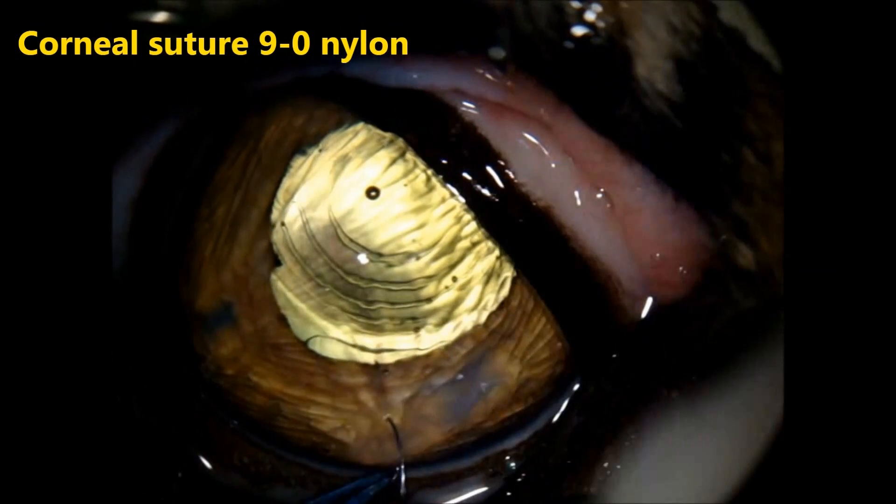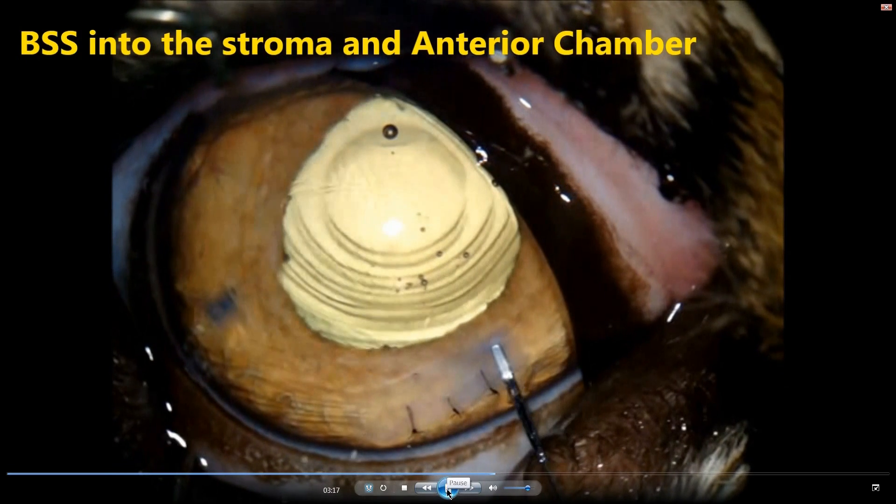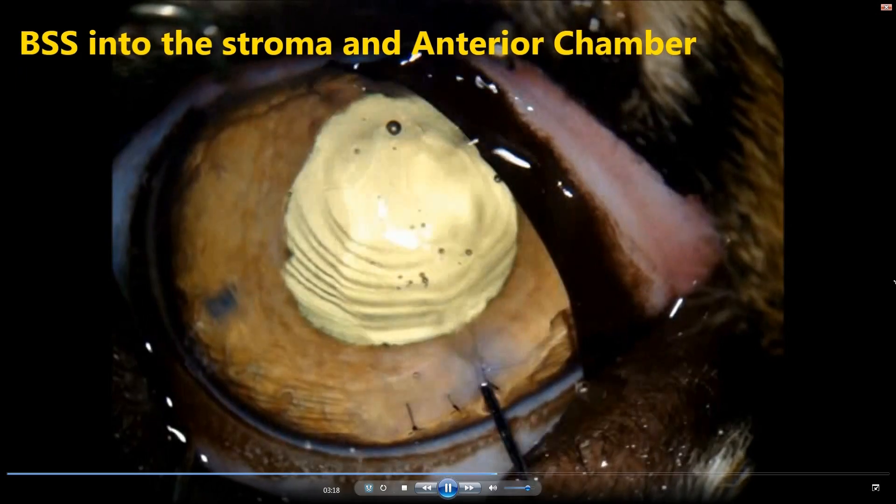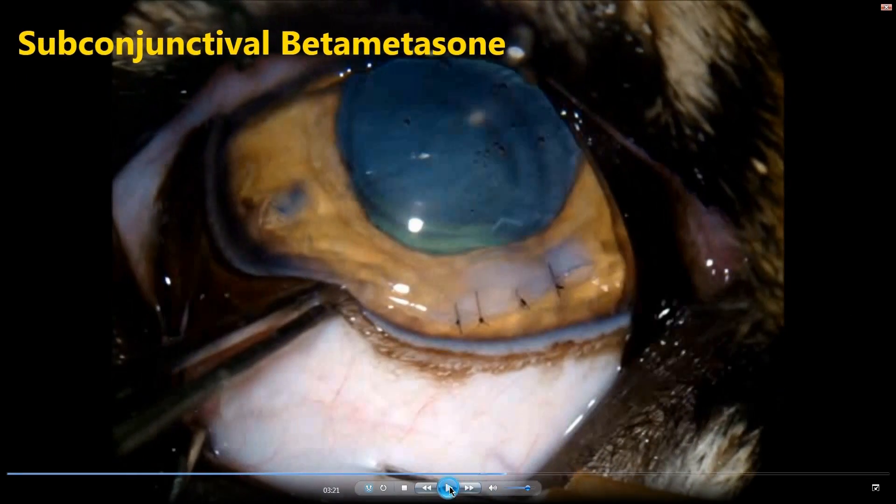Aspirating the viscoelastic and suturing the cornea with 9-0 nylon. This is a 6 mm incision, so usually 3 to 4 stitches are sufficient. Now we are doing a little stromal hydration using BSS and reinflating the anterior chamber. Right after the procedure, a subconjunctival injection of betamethasone — 0.3 ml — is used to prevent post-operative uveitis.